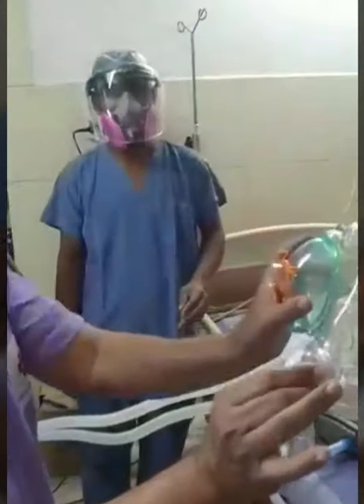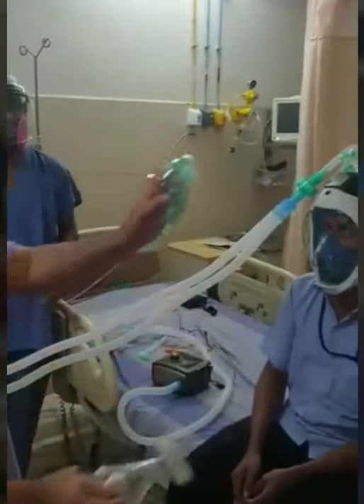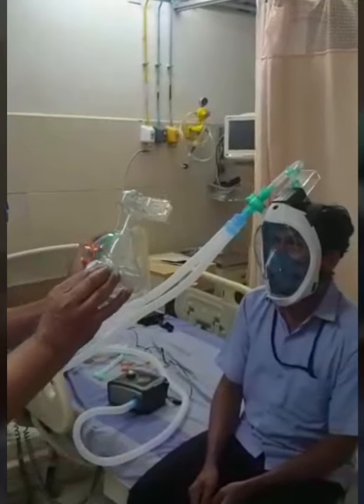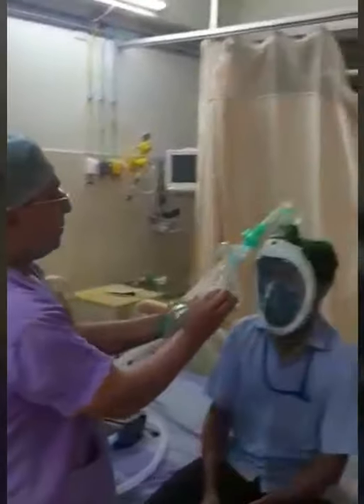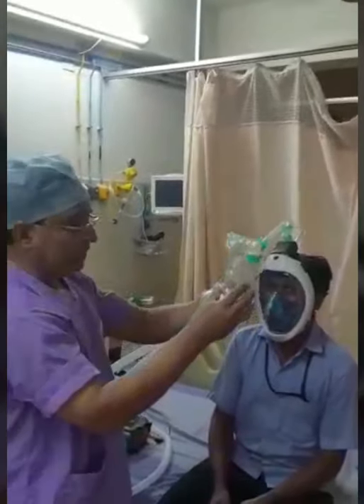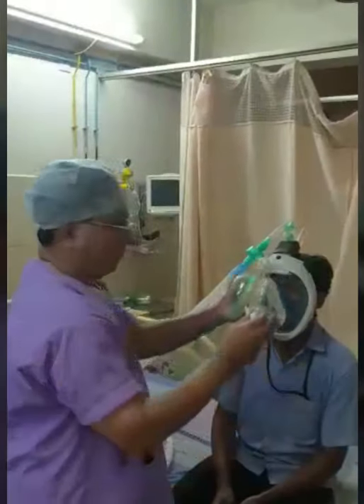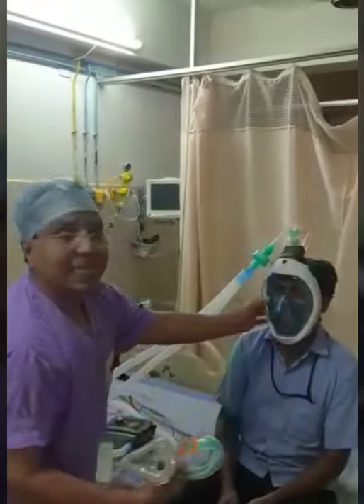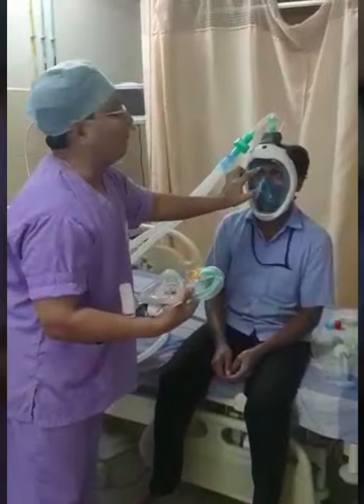This mask is nothing different from an ordinary mask that we use for giving NIV — non-invasive ventilation. When we use these kinds of masks for long duration on COVID patients, because of the pressure generated, they develop pressure sores along the lines on which these masks are fitting, because these masks are fairly rigid and the edges are not very smooth and not very comfortable to the patient. So with this snorkeling mask, we can achieve a better fit, less leak, and also more comfort to the patient.